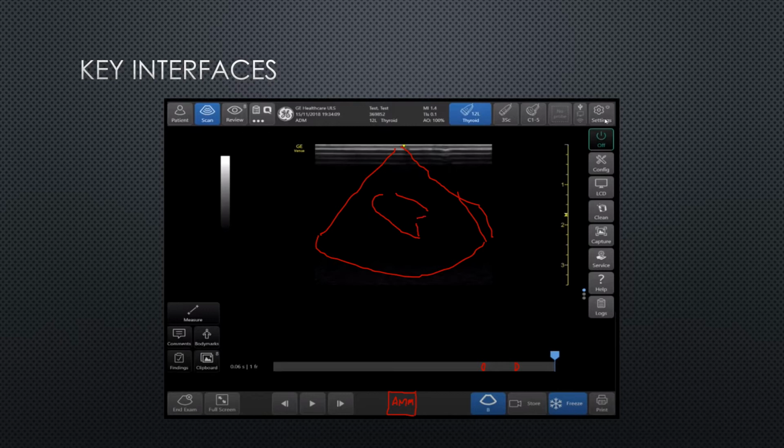So, in traditional M mode, you can only come from the center of the screen to get your M mode. So, you can come out here, but you can see that distance is going to be artificially increased because of your angle here, right? But what anatomic M mode lets you do is go, okay, I want to get the M mode image at this location, but from this angle. So you can essentially have a flat septum, even though on the actual screen it wasn't.